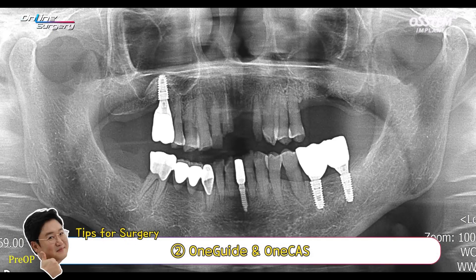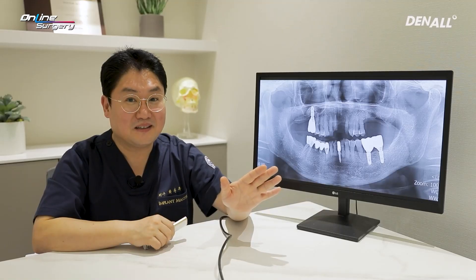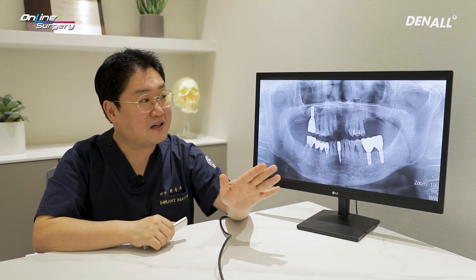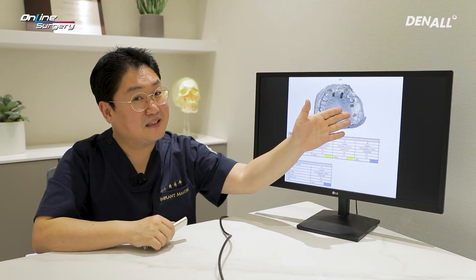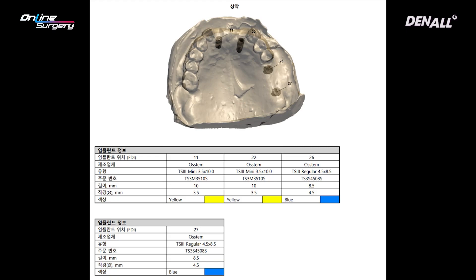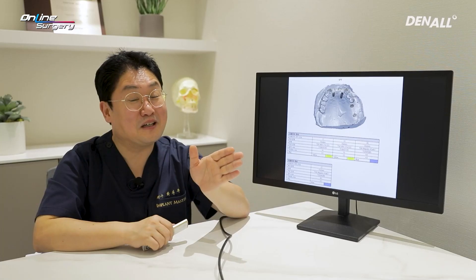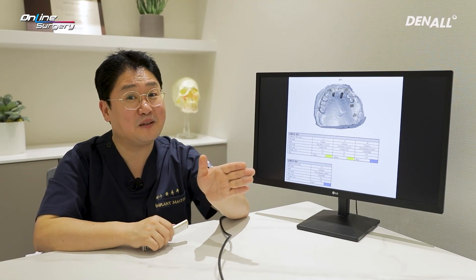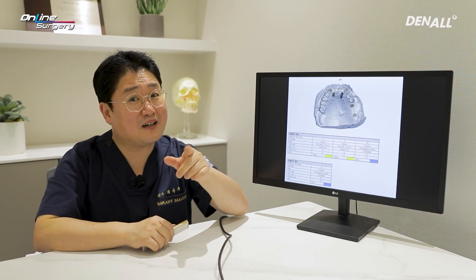OneCAS kit along with OneGuide was used. A crestal approach and a little bit of bone graft was planned. As shown, the plan was to use OneCAS system for guided surgery to place an implant in the upper posterior area. Crestal sinus lift would be performed along with a little bit of bone graft. However, this is a septum-like structure, so there is a high possibility of sinus membrane perforation.